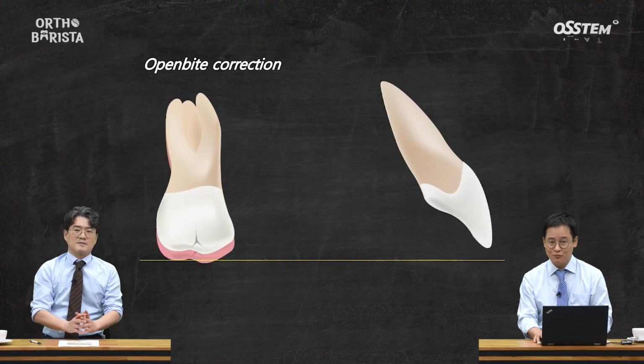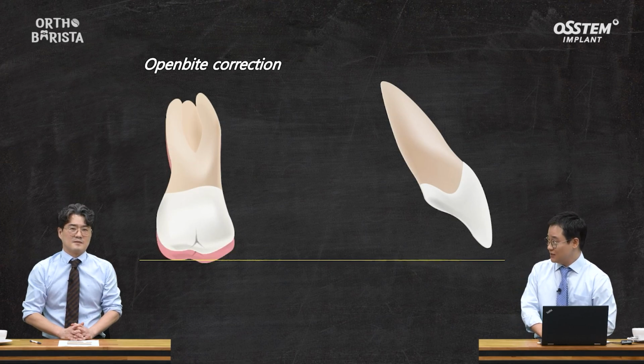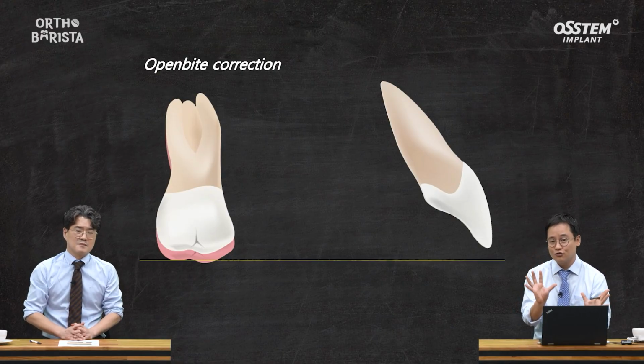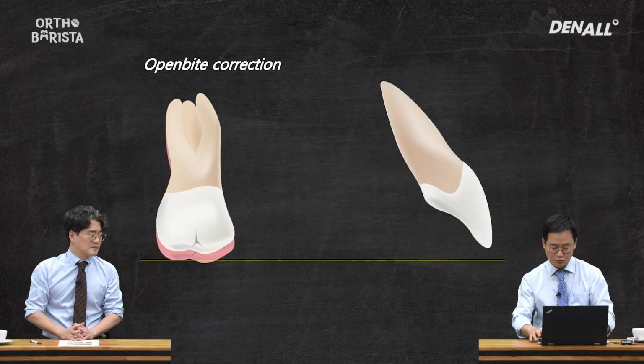For third, posterior region only will be moved up. This is very hard to expect in clear aligners. I mean, unless we use mini screws, this kind of movement is really difficult. So, the first two cases, extrusion of anterior teeth or intrusion of posterior teeth accompanied by extrusion of anterior teeth, are the most common movements we can expect in clear aligners without special screws.